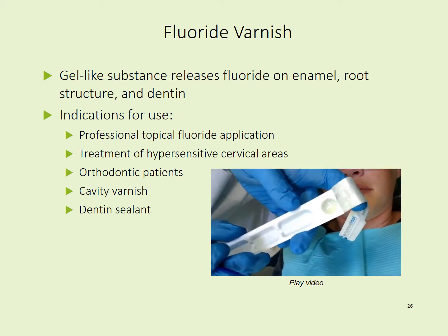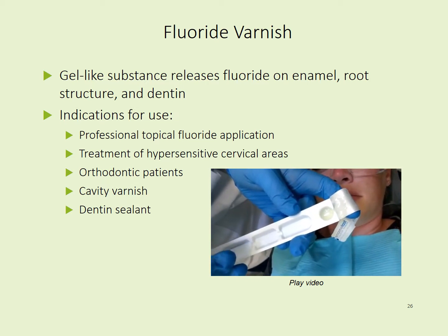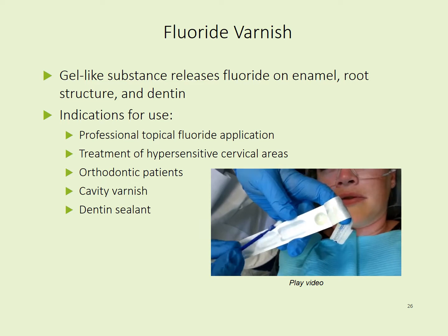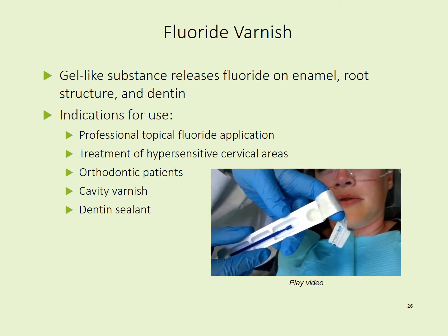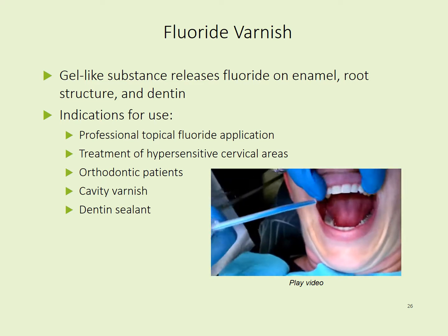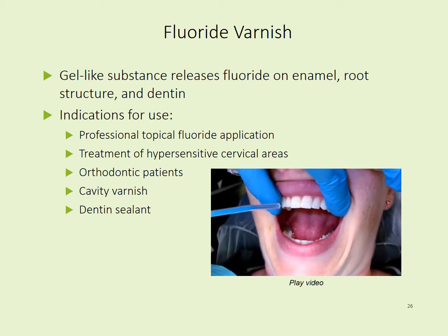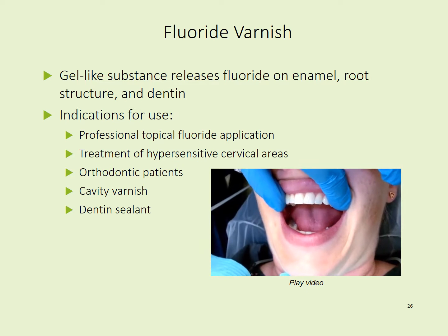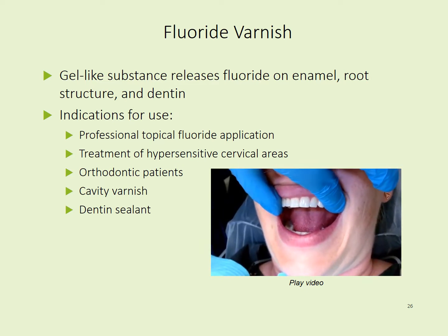When using varnish, make sure that you read the instructions for each brand because some say that you have to dry the teeth and some say that it's not necessary. I'm going to demonstrate how to dry off the teeth if the brand does recommend that. And there are two ways. You could use the air water syringe or the 2x2 gauze. If you keep your fingers somewhere in the mouth, the patient won't close and re-wet everything that you've just dried.